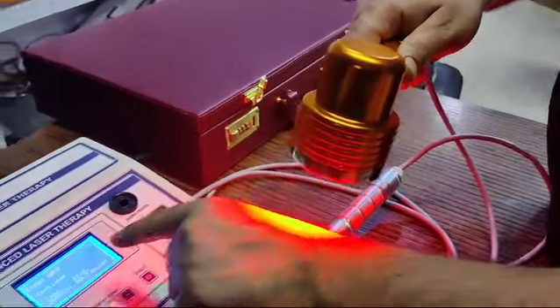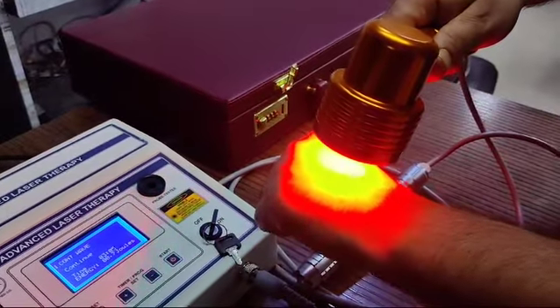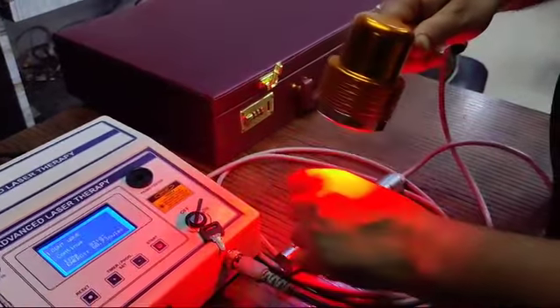As the timer goes to zero, it will automatically switch off. Thank you.